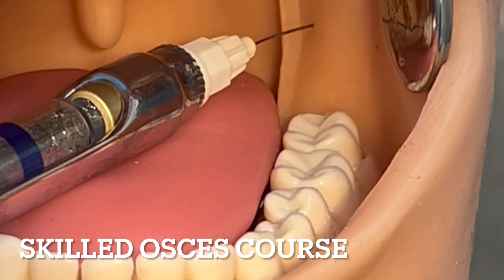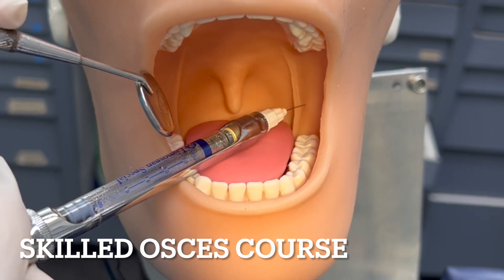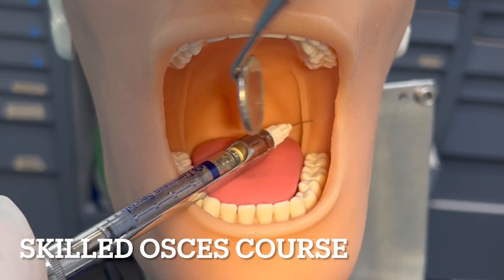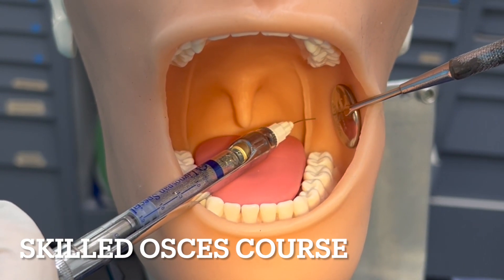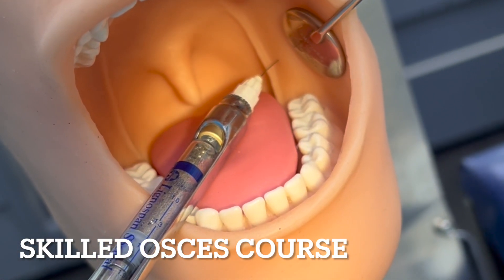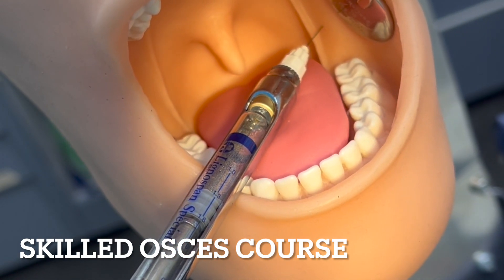Can you zoom out so they can see this. You slowly inject two-thirds of the carpule. This is suitable for a rubber dam for fillings and root canals, but not for extractions.